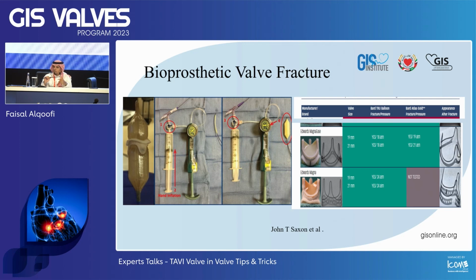The second point is valve-in-valve in SAVR. If you have already put a scaffold, like in this patient, and you need to put TAVR in SAVR, you might fracture before because you eliminate the risk of AI. But generally, you fracture later on because you might not need to fracture. So I think that's the important point. Go on, Faisal, because of the time for the live case.